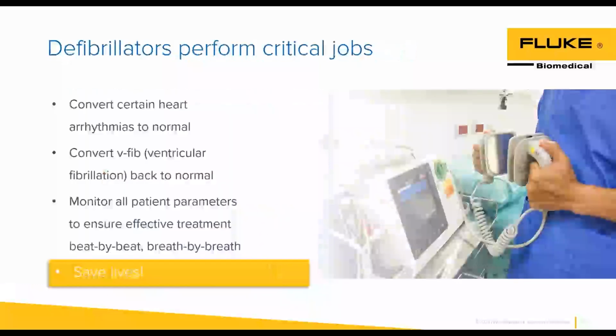Defibrillators perform critical jobs, and the main goal of defibrillators is to save lives and increase survival rate. Defibrillators deliver a shock to a patient to convert their heart back into a normal rhythm. And certain defibrillators not only have the ability to deliver this shock or energy to a patient, but also have the ability to pace a patient.